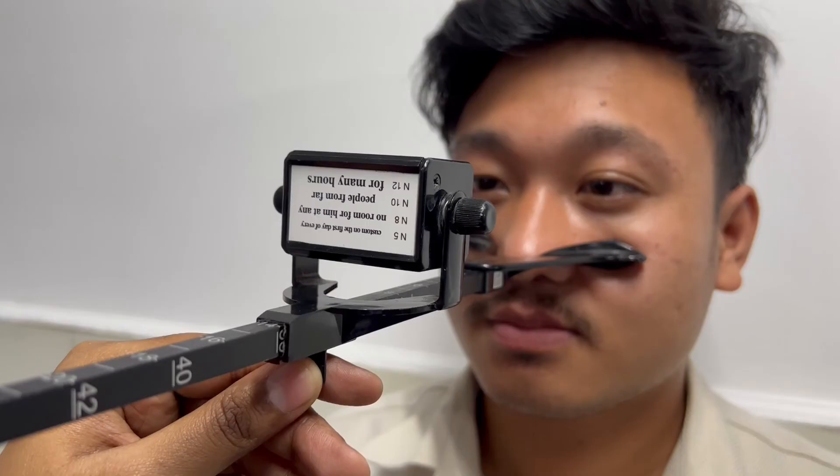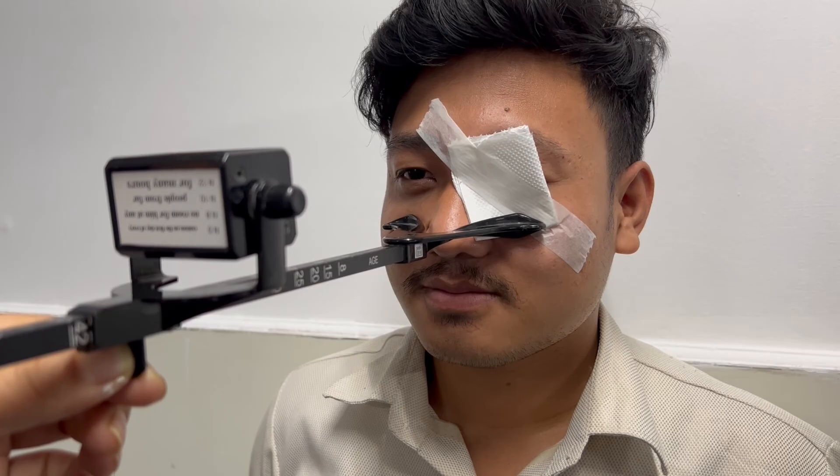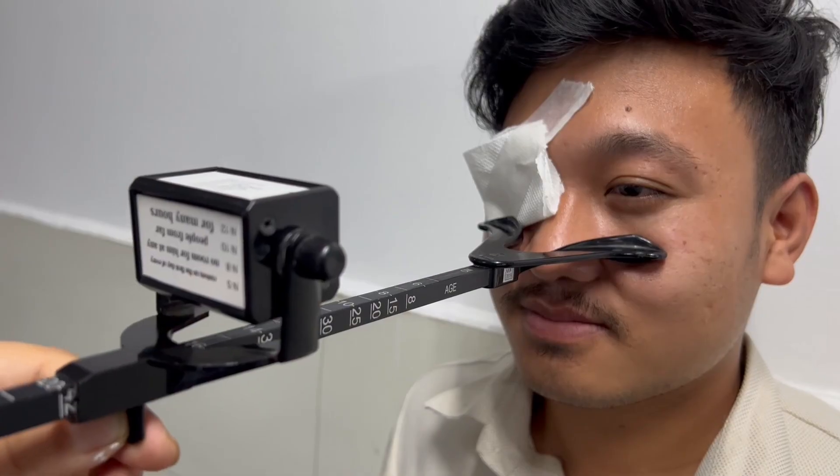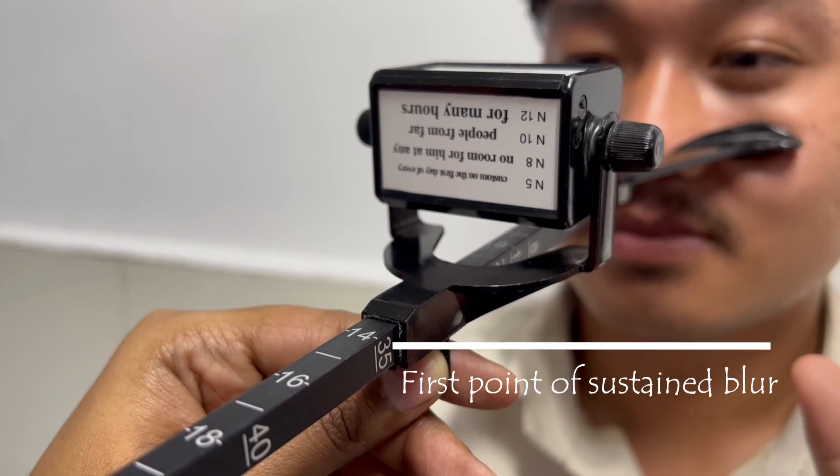The near point of accommodation is measured first binocularly, then monocularly, right eye and left eye separately. The first point of sustained blur is noted in centimeters.